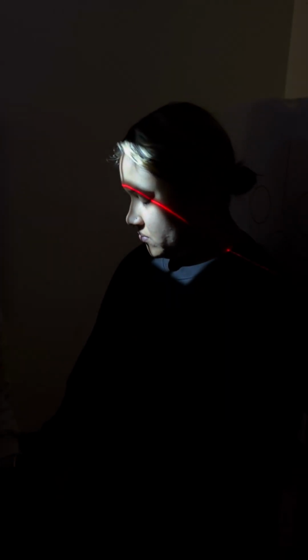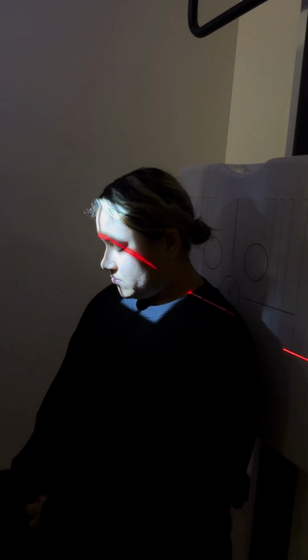The difference for this is you're going to tuck your chin down further even for me. There you go, just like that. And then come right between our eyebrows for me. You'll see, instead of the central ray transferring across the EAM that we did for the original Towns, what were we showing? The clinoid process out where the foramen magnum comes. Now we're looking at the zygomatic arches. So it's basically just coming right through the zygomatic arches. One is coming through the ear hole. The other one's coming across our cheekbones that we're actually projecting for.